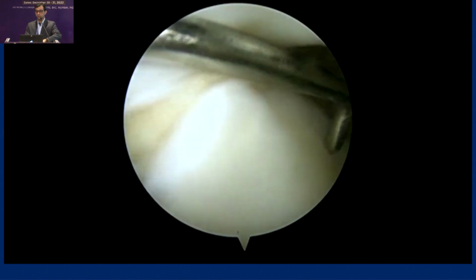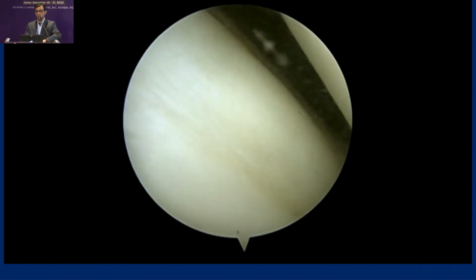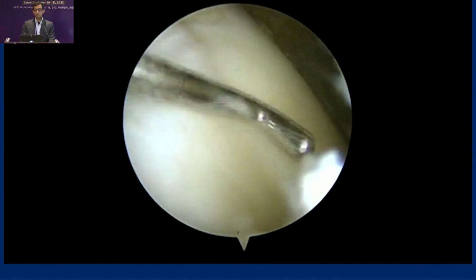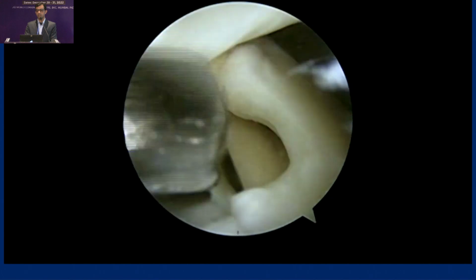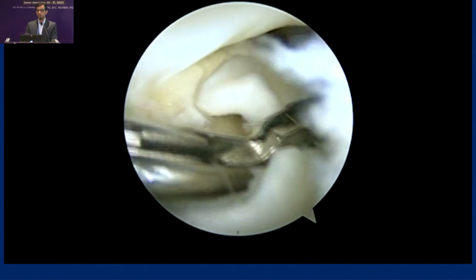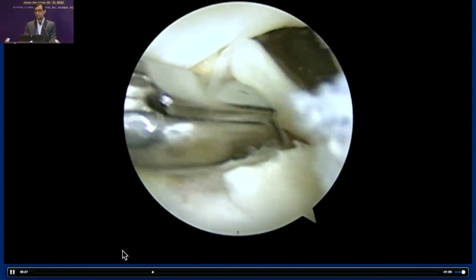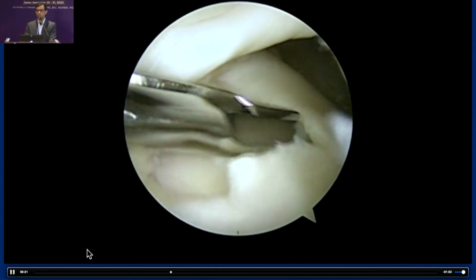You need to debride the fat pad clearly, and this is type 1 lateral discoid, which you can see is extending right up to the ACL. You can see the over surface of the discoid meniscus, the under surface. Start resecting the meniscus from the anteromedial portal. You may need to change the working portal to the anterolateral portal.